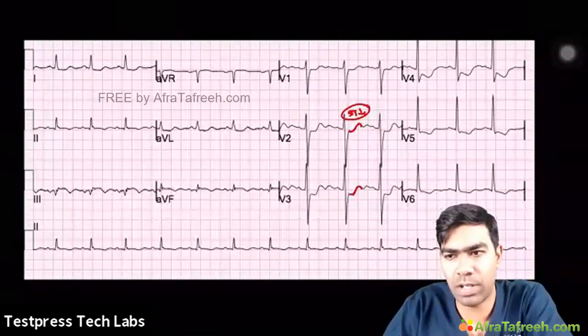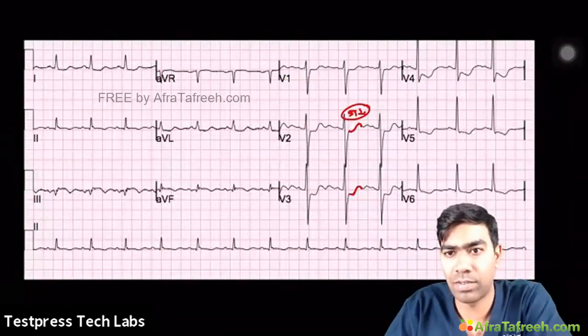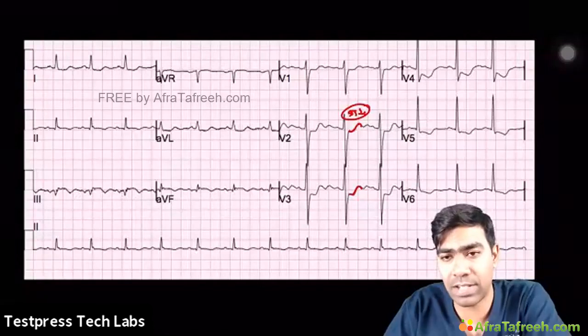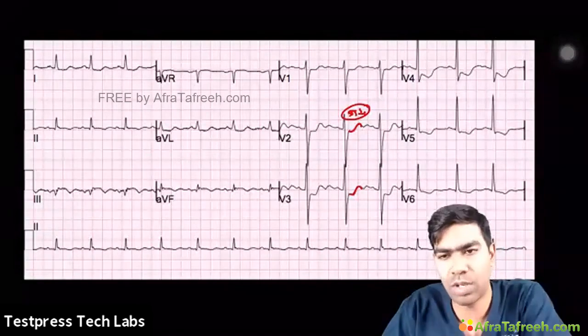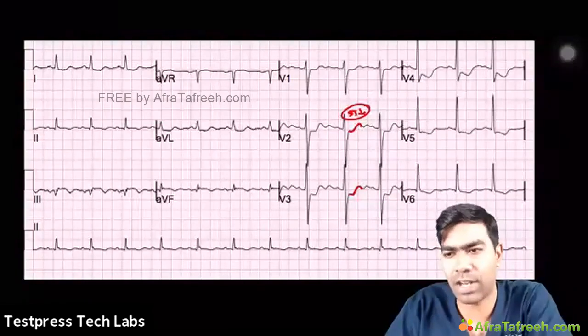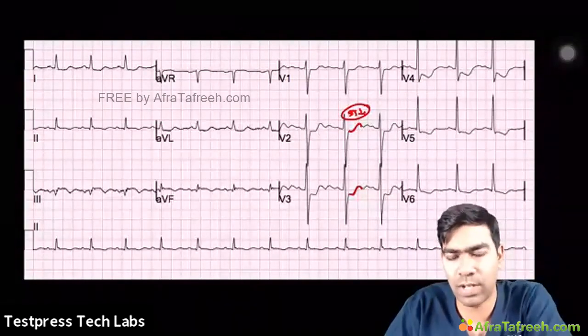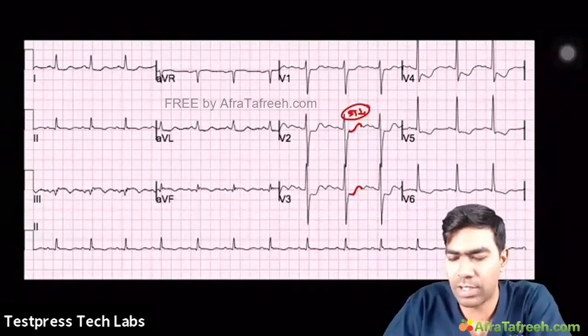Only repolarization abnormality, okay, fine, minimal ischemia. If you're having an injury current itself, which is a sign of when you have an ST depression, that is a sign of a severe injury and a severe ischemia. So this usually moves towards a severe form of NSTACS, very likely to be an infarct. But remember, infarct cannot be diagnosed unless you use the troponin values and you see the troponin values are elevated. So no need to comment on all these things here. So this is a more severe ischemia.